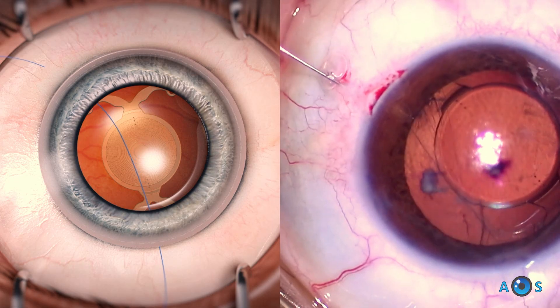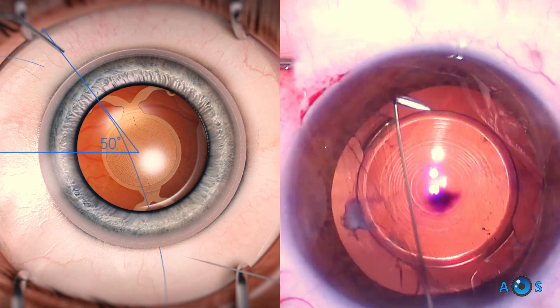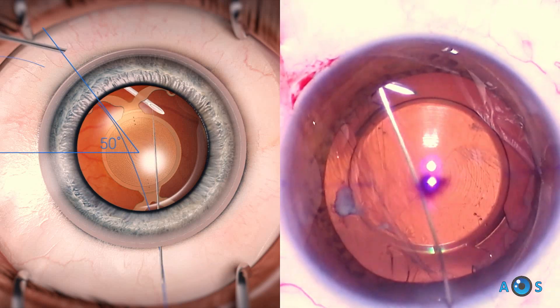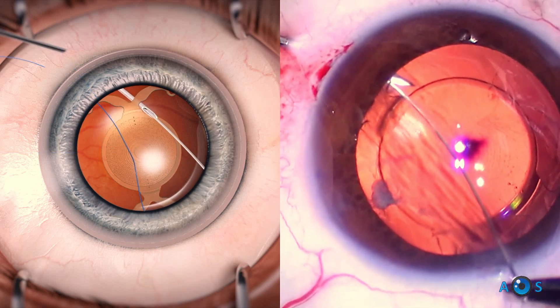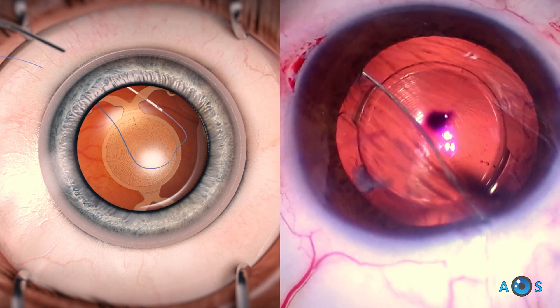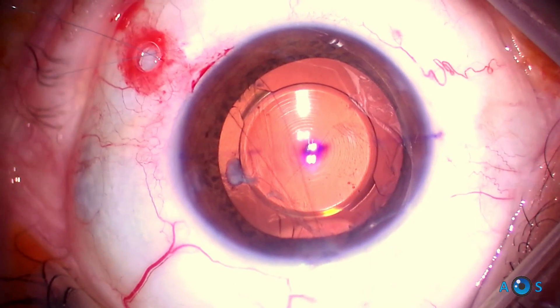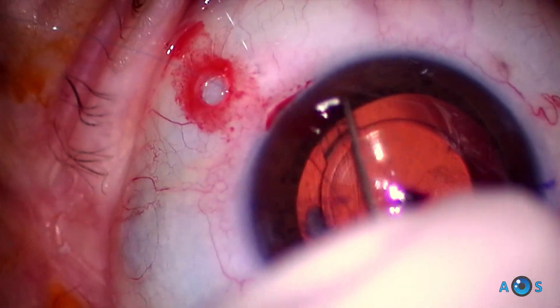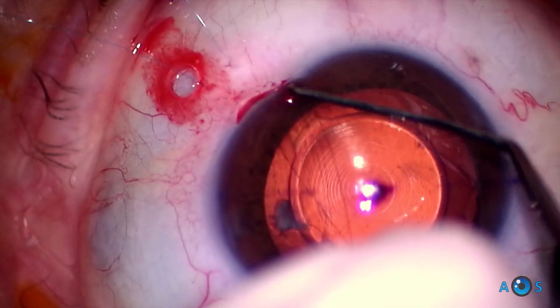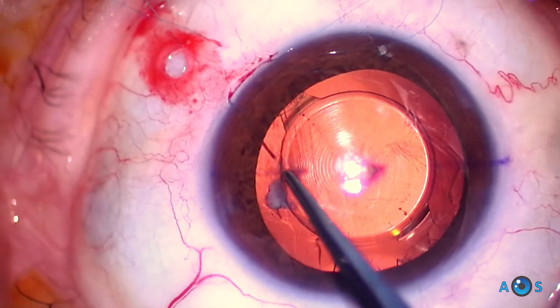The first arm of a double-armed straight needle with 10-0 prolene crosses the sclera at 40 degrees. Then the second arm crosses the sclera at 50 degrees. Both needles have crossed the sclera at the site of the Hoffman pocket, two millimeters from the limbus.